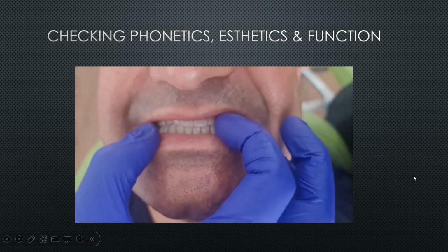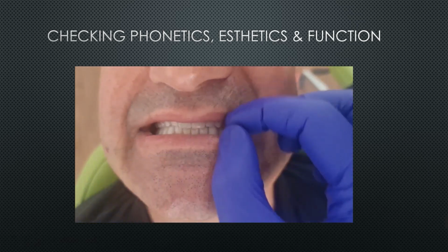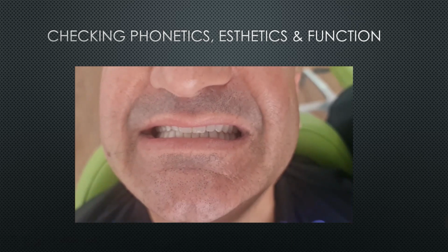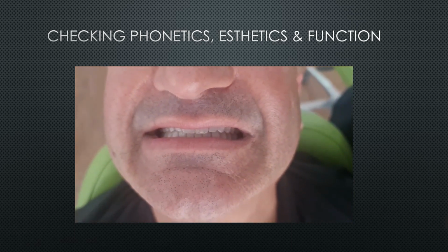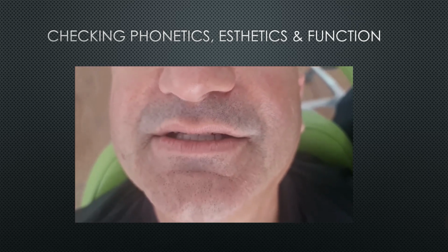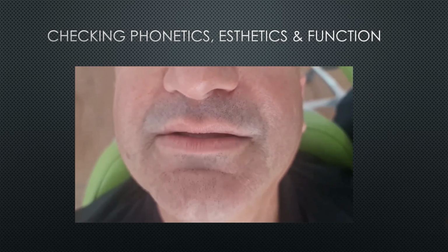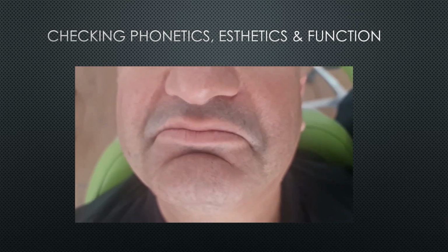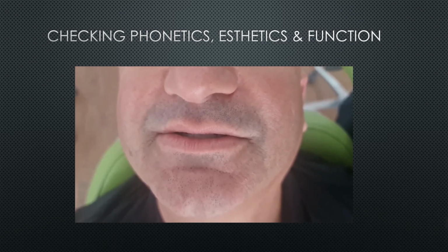Hello again. This is our patient. We made the rehab for him, and we raised his bite by like 2.5 mm because he had like severe attrition of his teeth. Now is the test time. So we'll ask a few questions for the patient. Can you say 66, please? 66. Flavor. Muhammad. Do you have any problem in the pronunciations of these letters? No, nothing to this problem. So if it's in Kurdish, shesh to shesh. Shesh to shesh. I see.